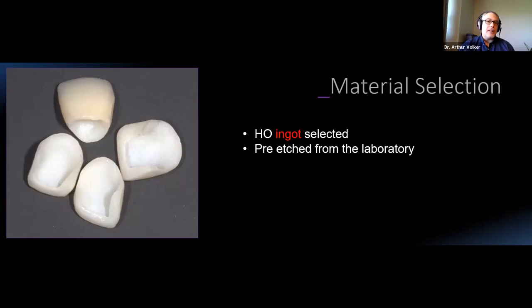And this to me is the best because on 3 of those 4 teeth, we were actually able to preserve the cingulum. And there's been some speculation that most of the structural integrity, or up to 70% of the structural integrity of an incisor lies within the area of the cingulum. So, is this a service for the patient? I would say I think so.